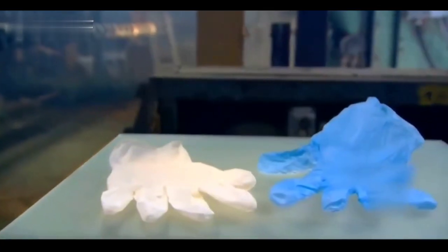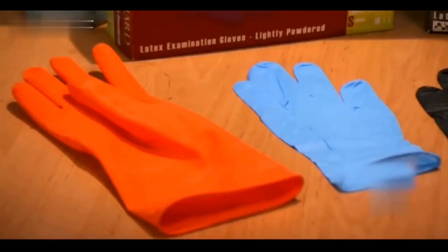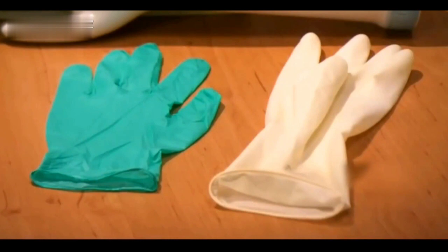The production of medical rubber gloves is now completed. The common medical gloves on the market are usually white and blue — but do you know what the orange and green rubber gloves are used for?